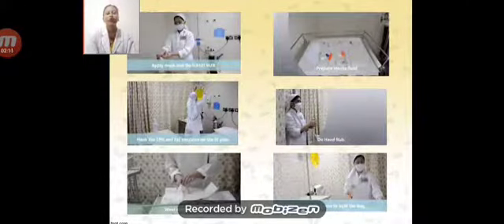So after applying the face mask, we can prepare a sterile field by again rubbing our hands with the spirit. We have to attach the TPN bag to the IV pole. We can rub our hands again, or we can wash our hands or rub our hands with hand rub, before applying the sterile gloves.